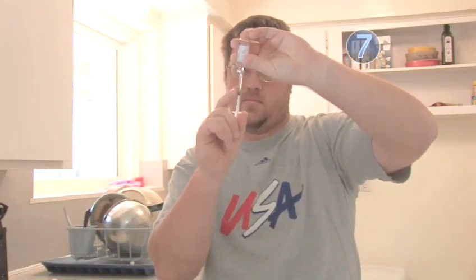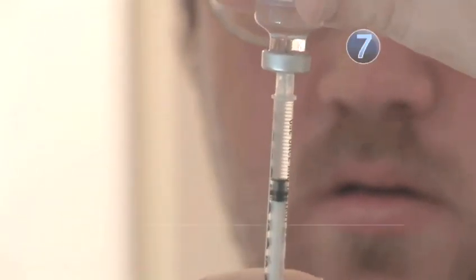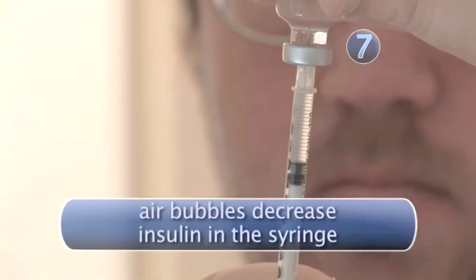Step 7: Air Check. If you see any air bubbles, tap the syringe with your finger to make them rise to the top. Slowly push in the plunger until all the bubbles are gone. Return to your dosage level and remove the needle from the bottle.